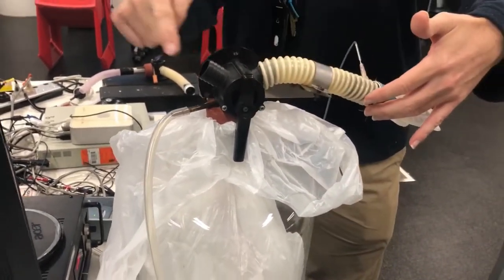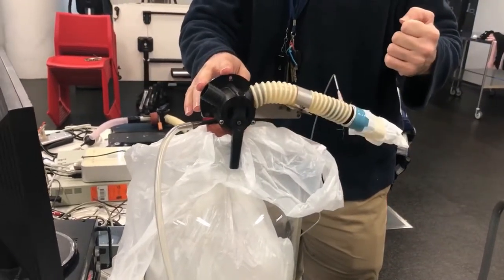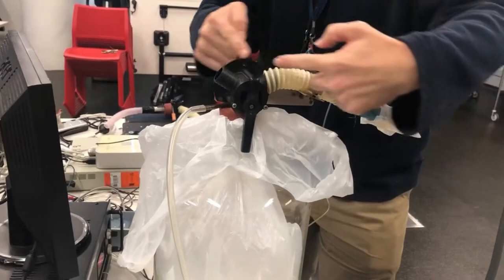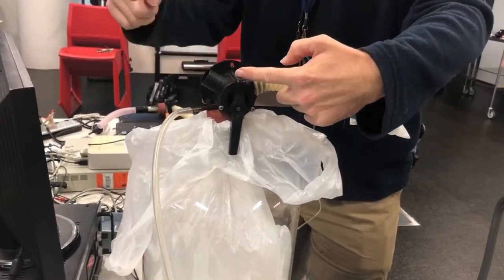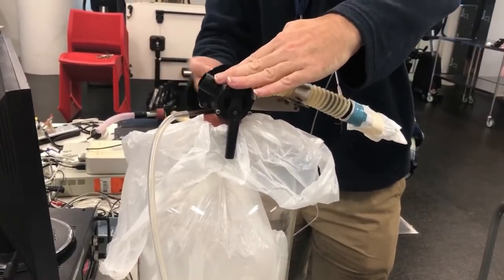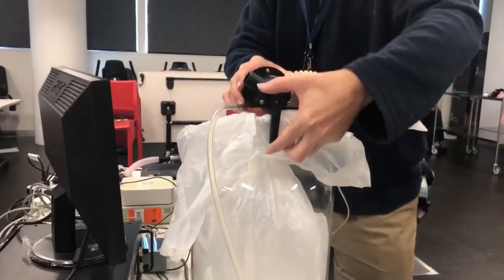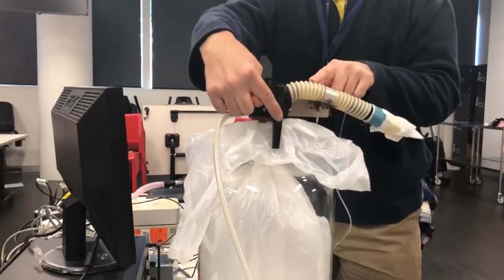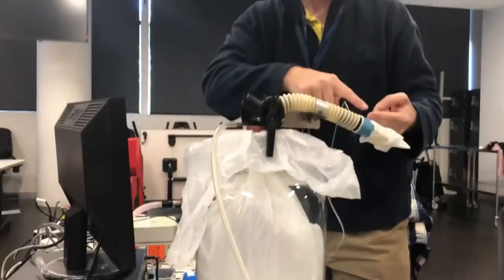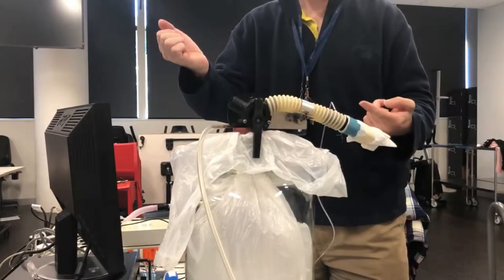At the moment the mouthpiece is open through this port, which means the bag is closed off — the handle is pointing down. When we want the student to breathe through the bag we turn this upward, so the long handle points at this valve and closes off the external nozzle, meaning the mouthpiece is now open to the bag.